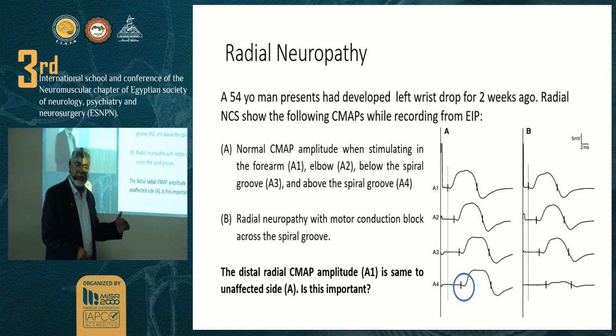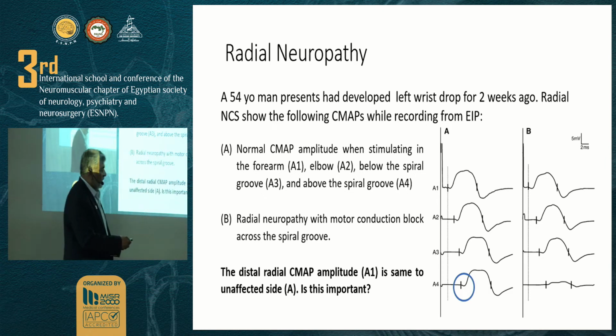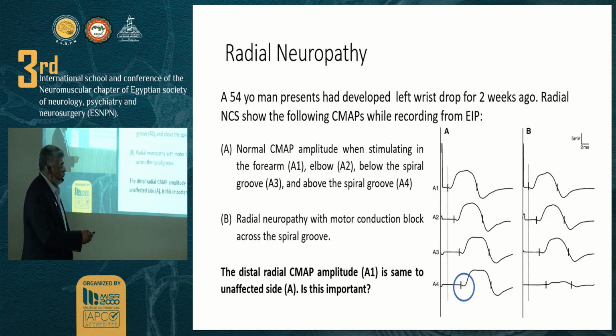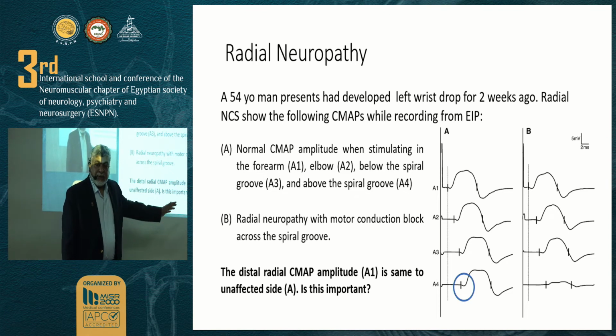If you find a conduction block, you are golden. It tells you where the pathology is. So this is at the forearm, lower arm, after the groove and before the groove, the radial groove. And there you go, you get a C-map which is a reduction in amplitude, and that tells you a conduction block.